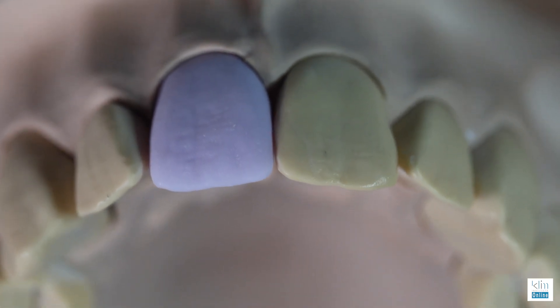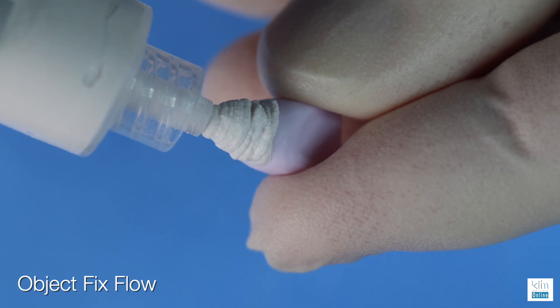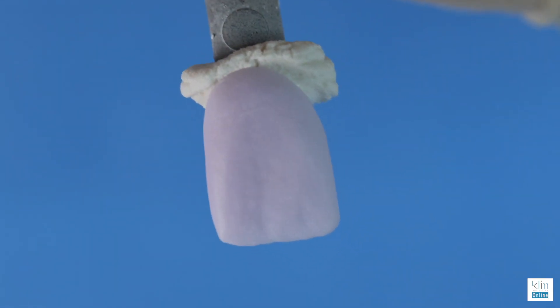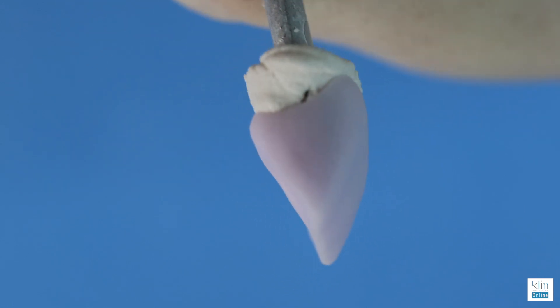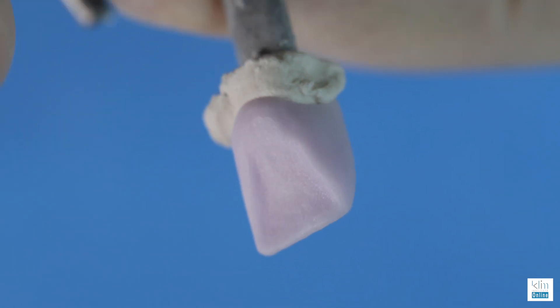There's nothing like texturing — it's the fingerprint, it's the chemistry of the case. Fill the restoration with Object Fix Flow and overfill. Plunge in the die pen — that should seal the margins. If you see any gaps, go ahead and tease that Object Fix Flow into place so the margins are sealed. We want good support during the firing and to keep the glaze out.